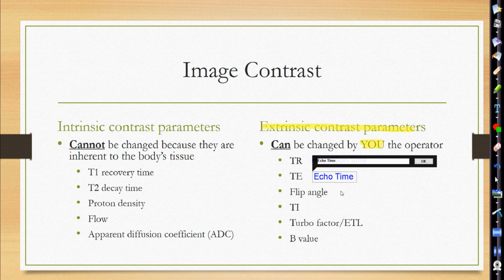Flip angle we already talked about, right? What determines a flip angle? What were those 2 things that determined a flip angle? The RF pulse. Close. The RF pulse, but how long it's on, and the amplitude, not the frequency, because remember the frequency is always the same because it has to match what frequency? The precessional frequency, or the Larmor frequency.